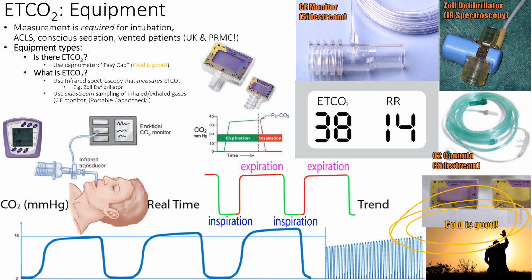So is there end-tidal CO2? That's all this says: is there CO2 present? But there could also be vomit present. There could also be epinephrine from an endotracheal administration of medications. That could also be why. But what is the end-tidal CO2? What is the trend? That's where we get a waveform on the monitor. We get our end-tidal CO2 waveform. That's what we want to see.